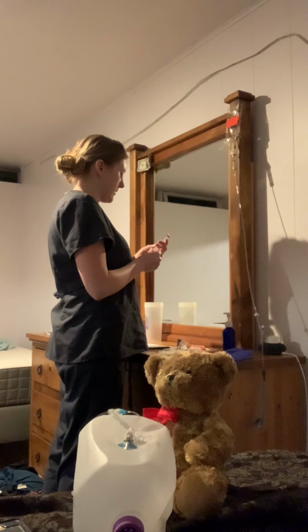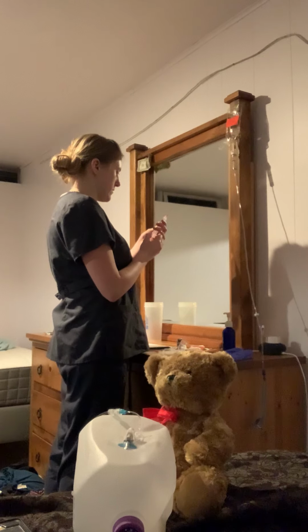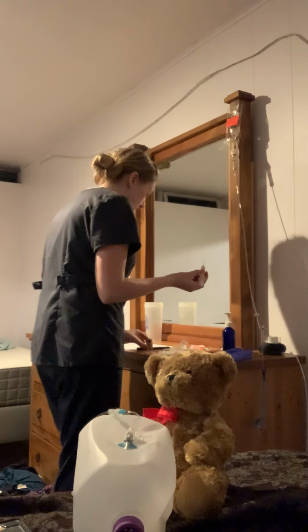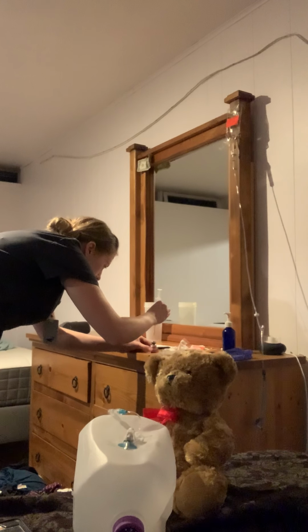Again, I'm drawing up 4 mils, so I'm going to inject 4 mils of air into the vial, and this just creates a vacuum effect. Now just using a sterile technique, not touching the plunger.